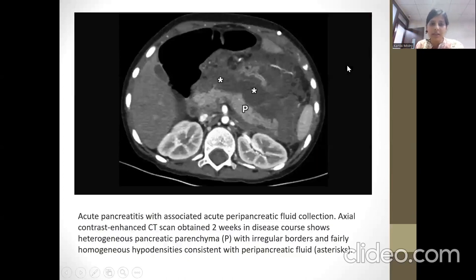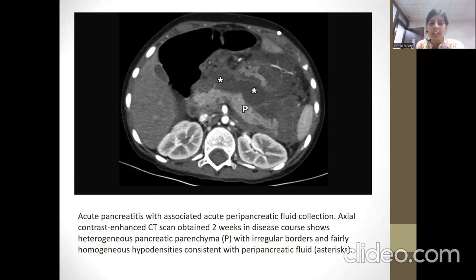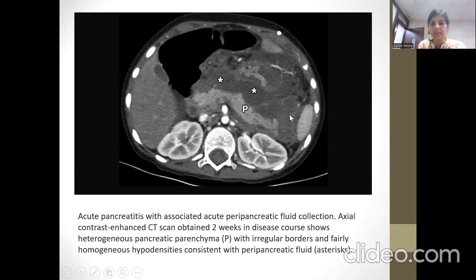Another CT scan image shows acute peripancreatic fluid collection with acute pancreatitis. You can see irregular borders, heterogeneous pancreatic parenchyma, and fairly homogeneous hypodense peripancreatic fluid collection.